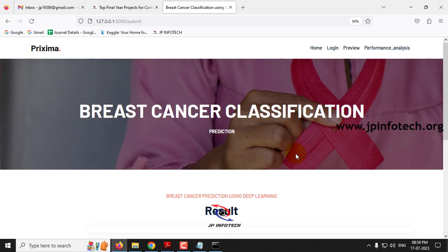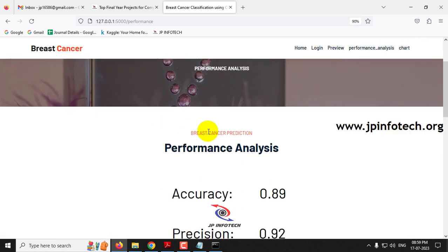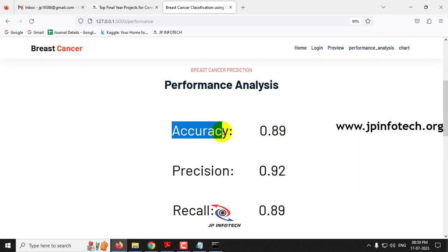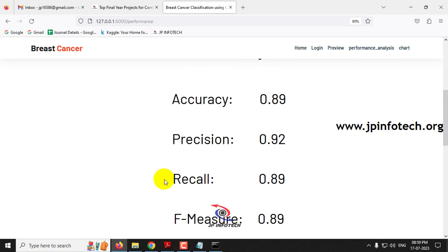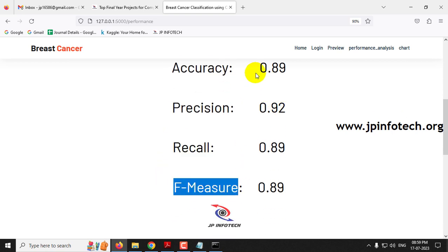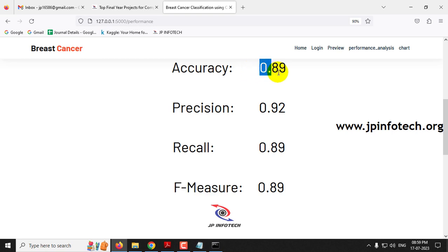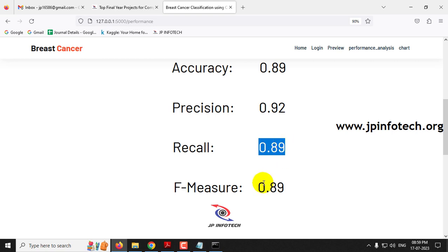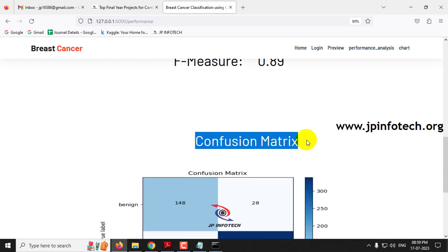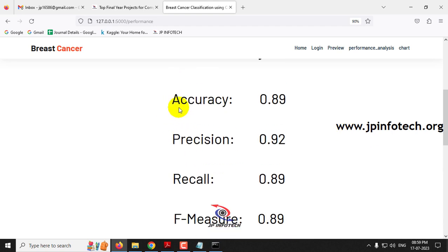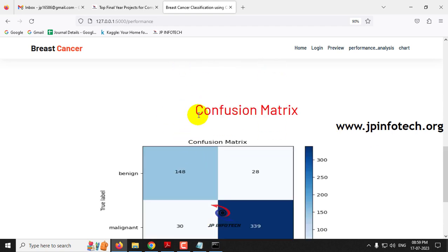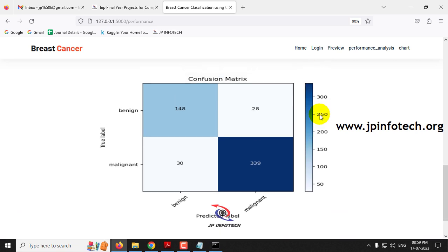Now let us move to the performance analysis part. Click on performance analysis. Here you can see the performance parameters: accuracy is 89%, precision is 92%, recall is 89%, and F-measure is 89%. You can also see the confusion matrix, which shows the true versus predicted labels for both the benign and malignant cases.